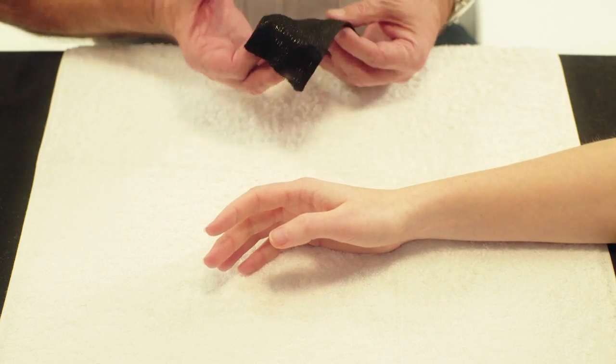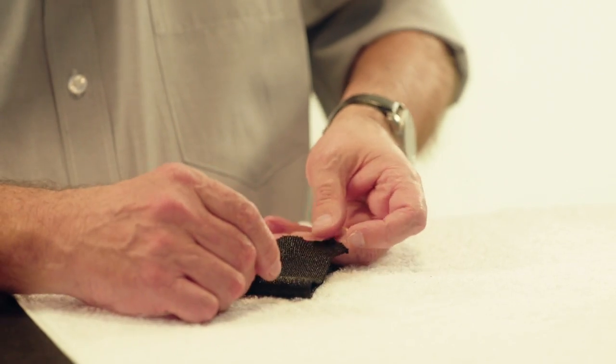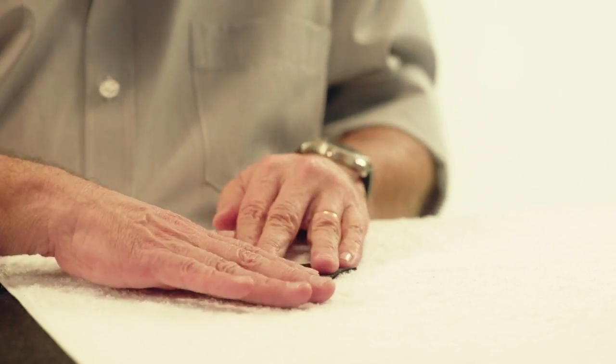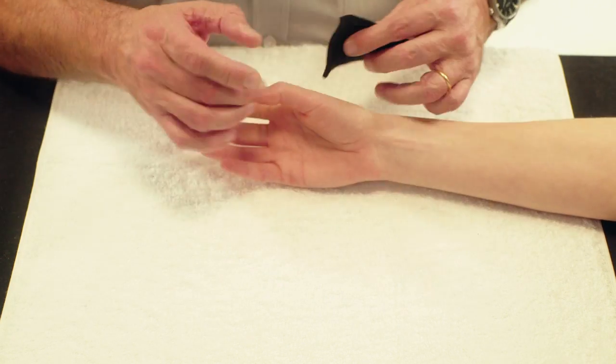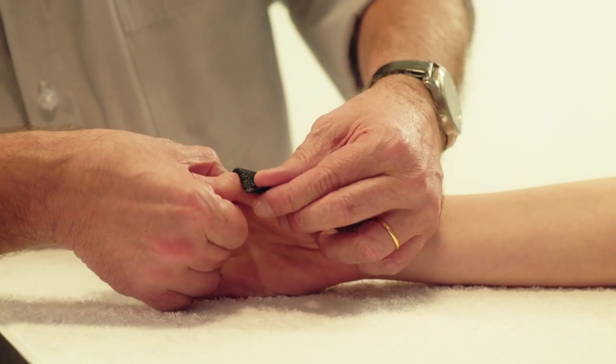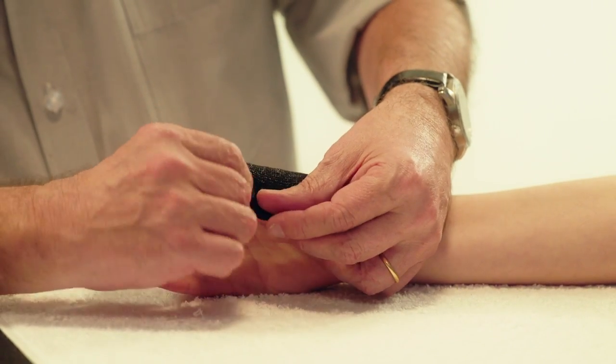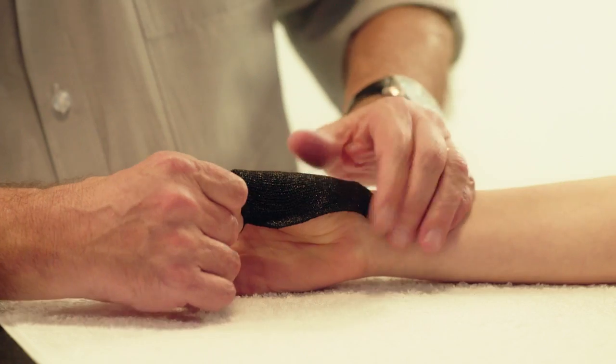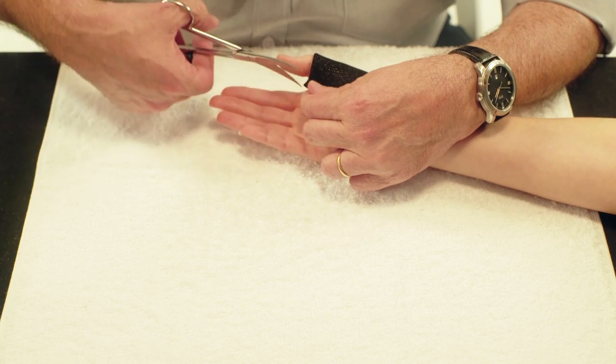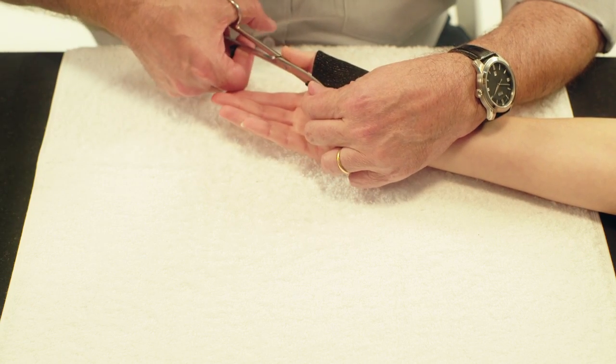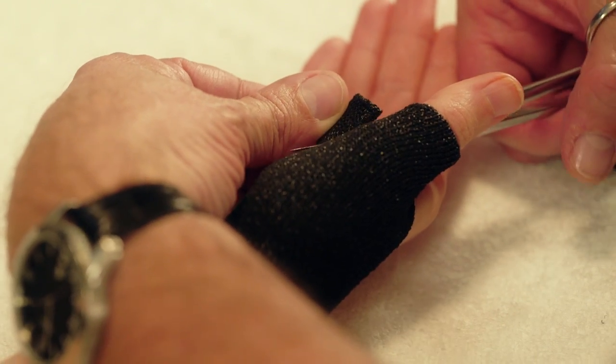Heat the material and fold it in half. Begin by anchoring the end of the Orphicast on the dorsal part of the thumb, just below the IP joint. Pinch the two corners together on the palmer side of the thumb. Cut away any excess material.